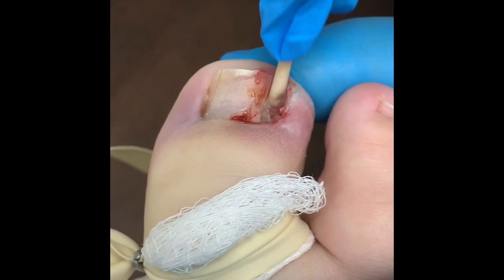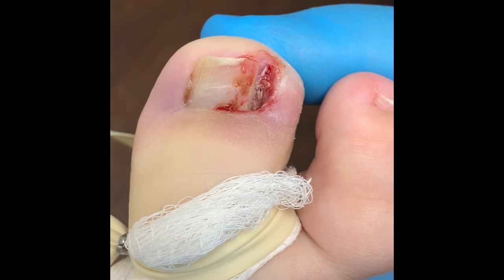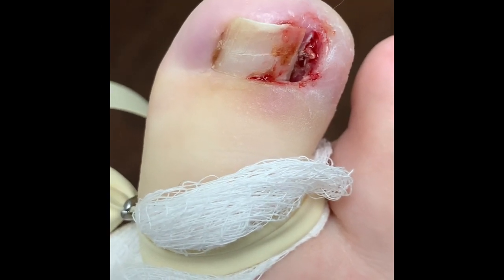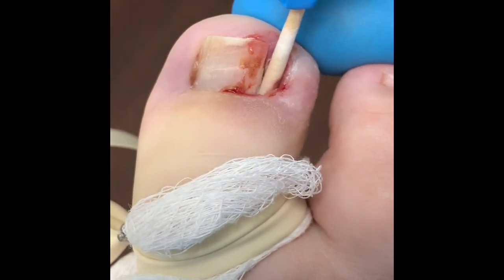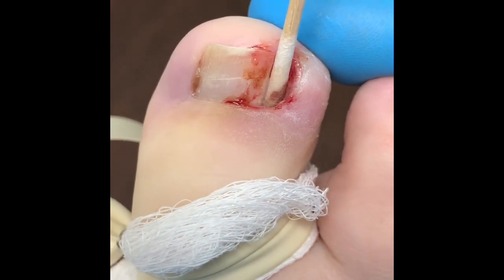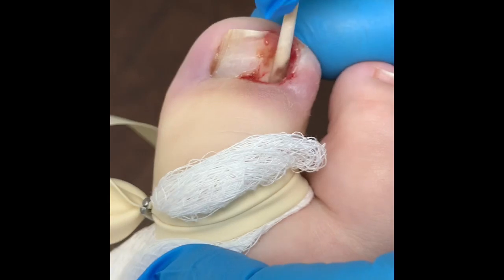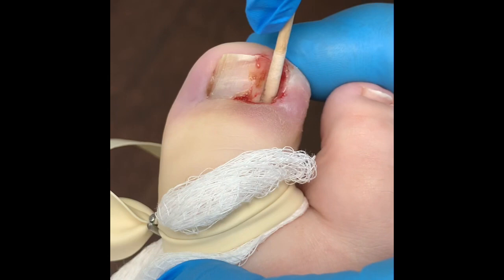Three strikes and we're out — this is now the third attempt at this. This is my first time on this patient. The only thing I would do on a recurrent one like this is to actually physically use cold steel and use a scalpel and remove the matrix itself. Well, let's keep our fingers crossed.